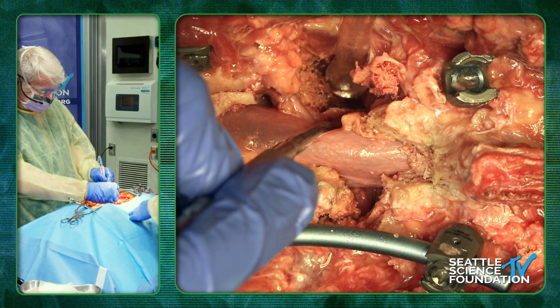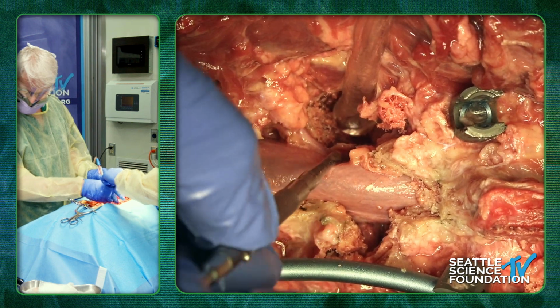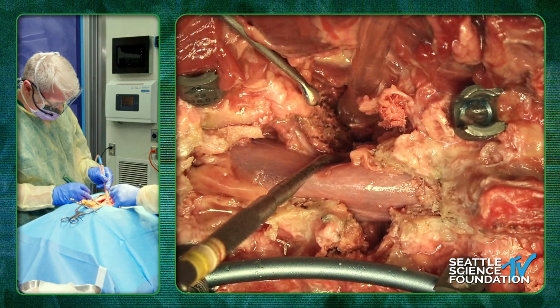Okay, so now what we're going to do is you can see here, I'm going to take some of the posterior wall down. Can you guys see the posterior wall? You want to hold this? So there's the posterior wall. And so we're going to take that down, and as a triangle as well, aiming for the other pedicle.